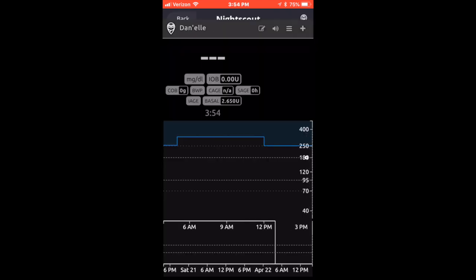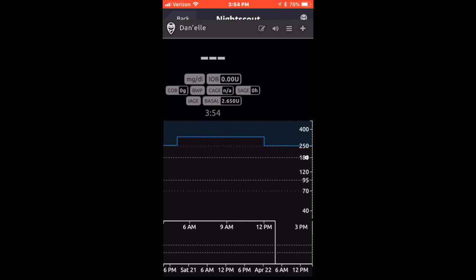You can also use NightScout with this. I already have my NightScout set up — I've used it before. Right now I'm still using the Dexcom app for another week, but I do like the Spike app a lot and I will be switching over and trying it out with my Dexcom.